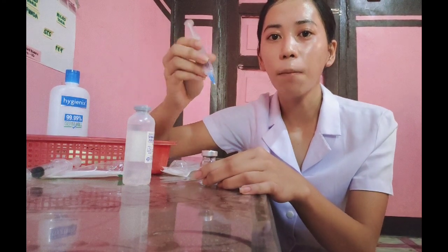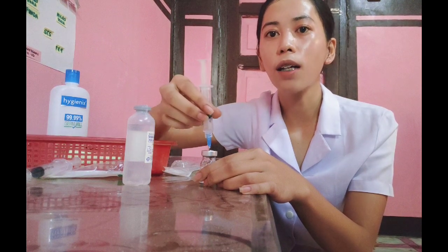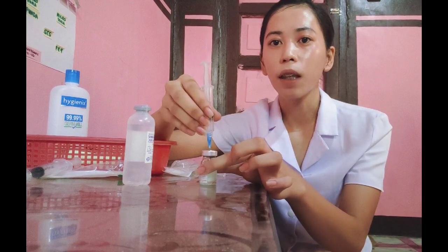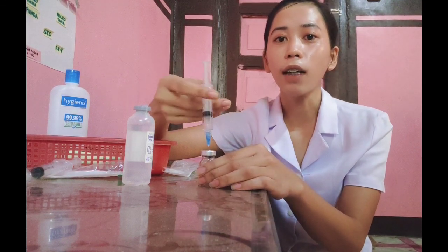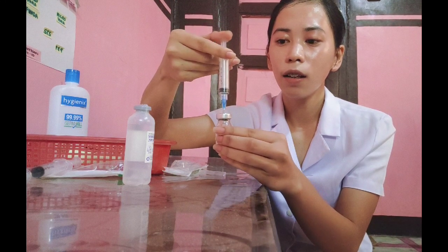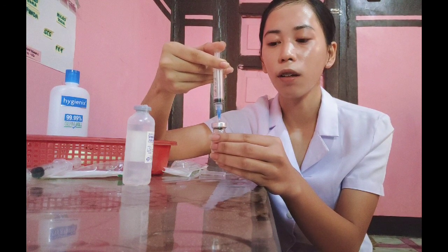Carefully insert the needle into the upright vial through the center of the rubber cap, maintaining the sterility of the needle. Then, inject the air into the vial, keeping the level of the needle above the surface of the medication.